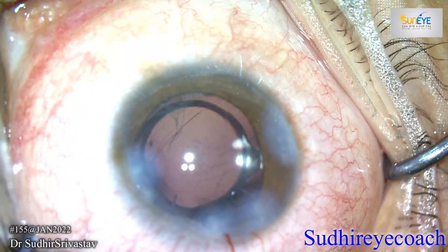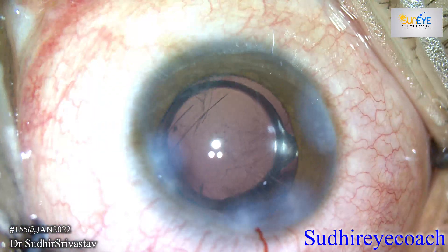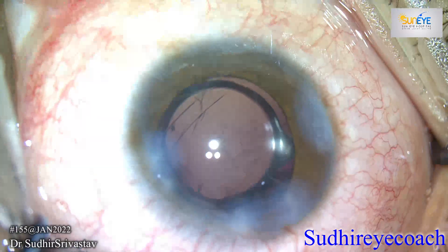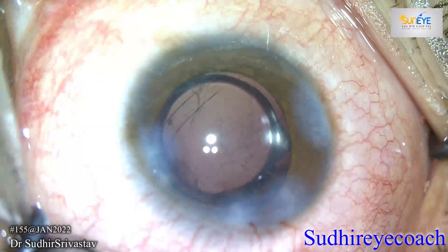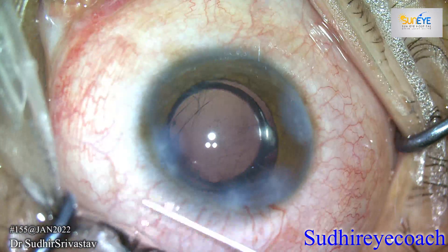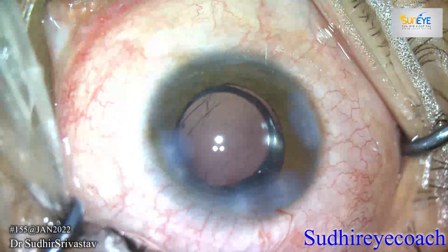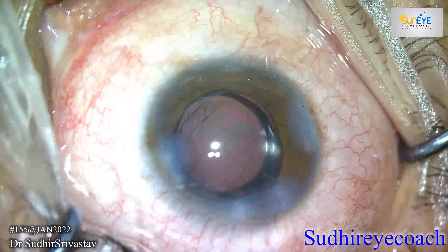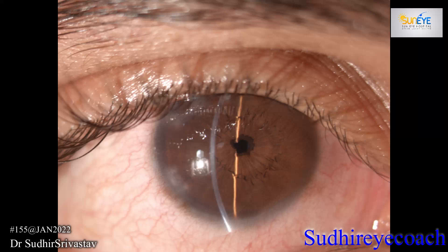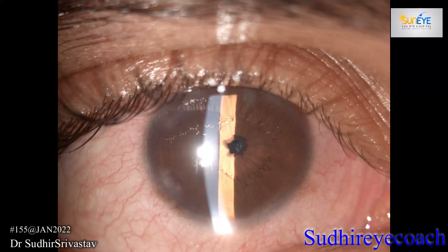Before surgery, I kept a multi-piece intraocular lens on standby to implant in the sulcus, or if needed, I could also do scleral fixation. Before closure, I ensured proper sealing of all incisions and pupillary constriction. At the end, I was happy to see a stable and well-centred intraocular lens. Every surgery is different and I have shared my experiences — please share your opinion. The first post-operative day the patient was very happy and the vision was 6/9.